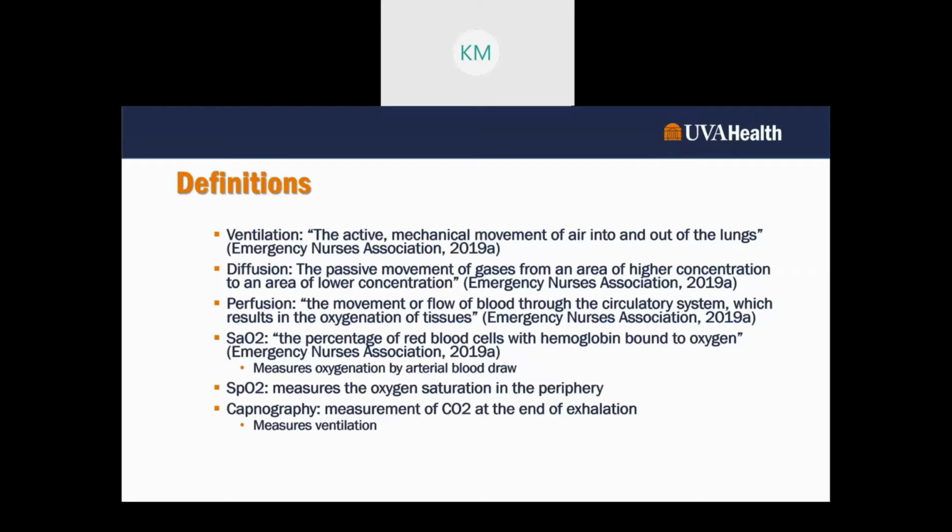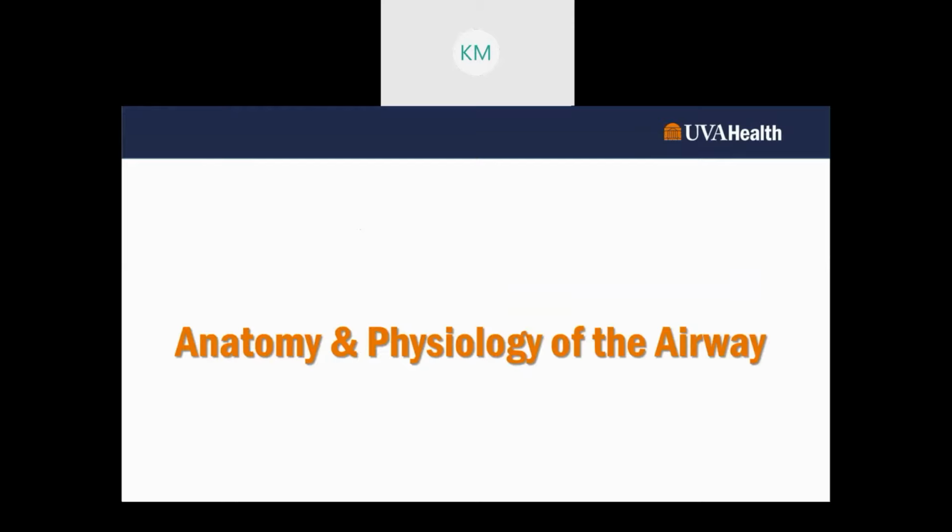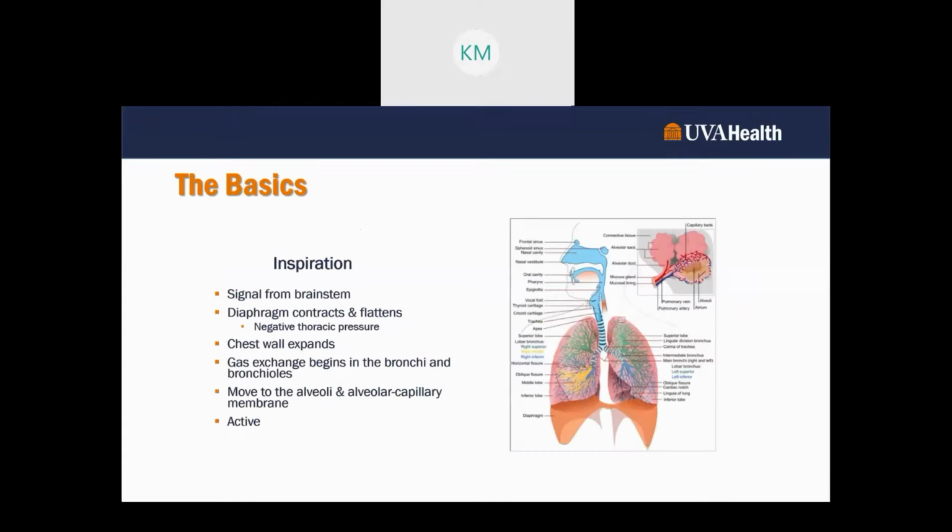Capnography itself is the measurement of CO2 at the end of exhalation. And this is going to help us measure ventilation, that active mechanical movement of air into and out of the lungs. So let's talk a little bit about anatomy and physiology, right? Kind of good to know where we start from.